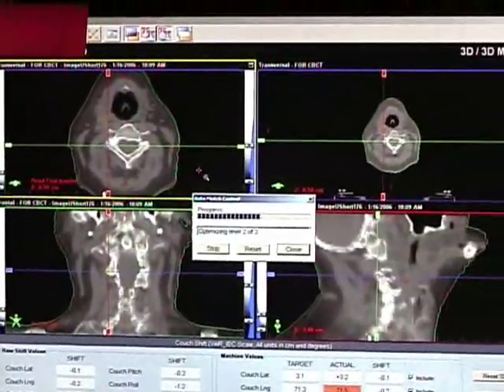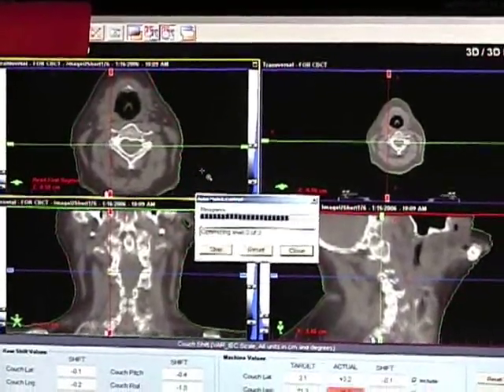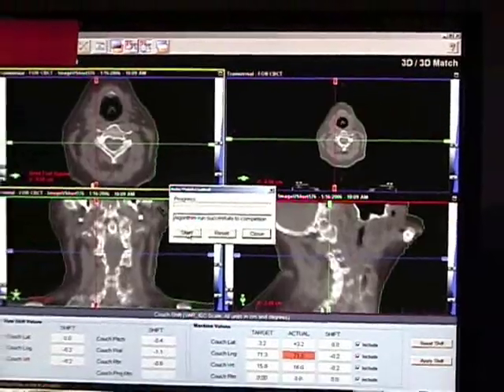By the way, if you notice on a 3D image, there's no ROI possible. So that's a future improvement. They're going to introduce ROI on the cone beam CT as well. So it's successfully complete, so we can close.